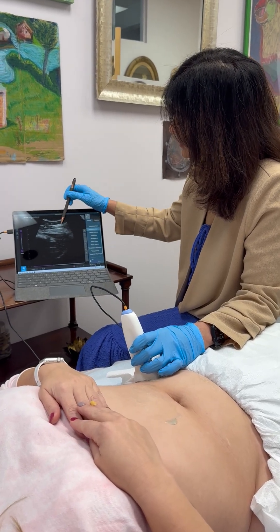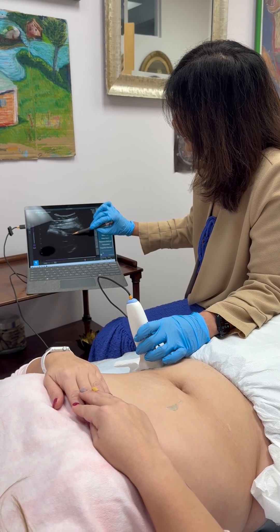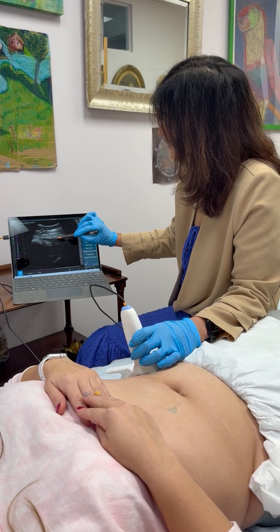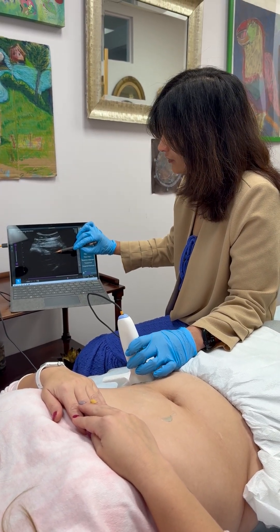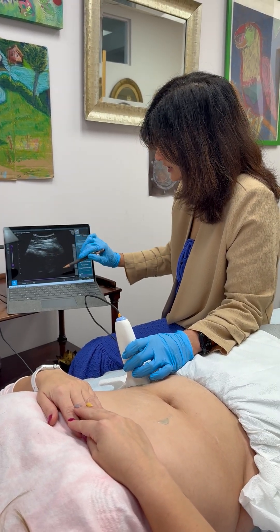Now we are not so much concerned about these two top layers, but this oblique and this TA should not be more than a ratio of two to one. So you see how this guy is thick? This should be half — but no less than half — of this size.